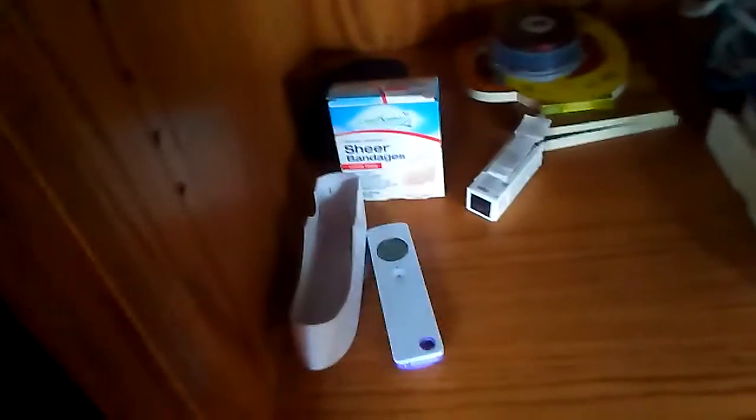This thermometer here is the ear one, so I'm going to use it on my forehead and see what my temperature is. You see here it's 96.9 and then the other ear is 98.1.